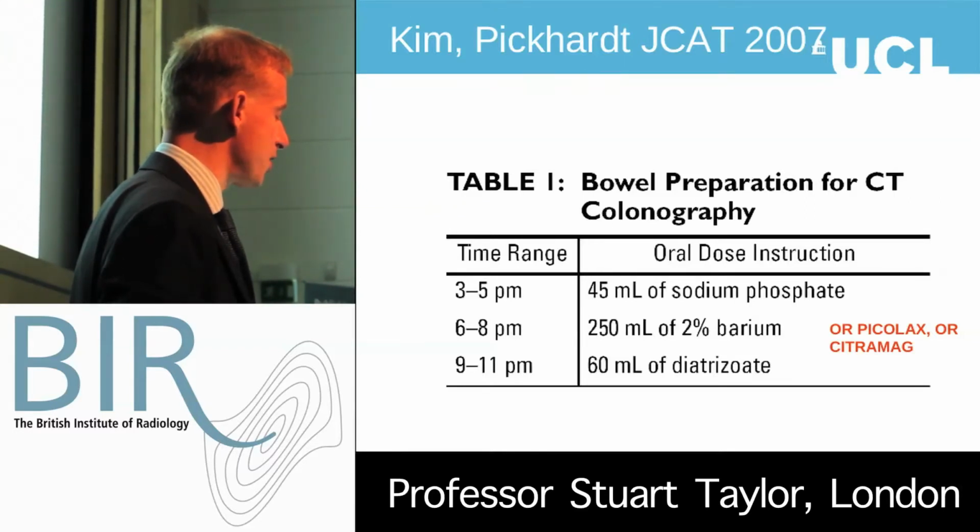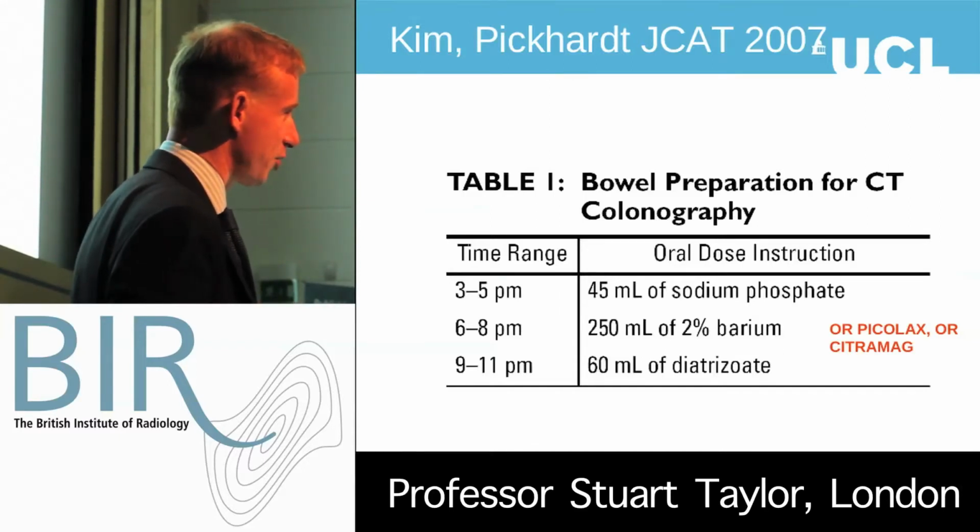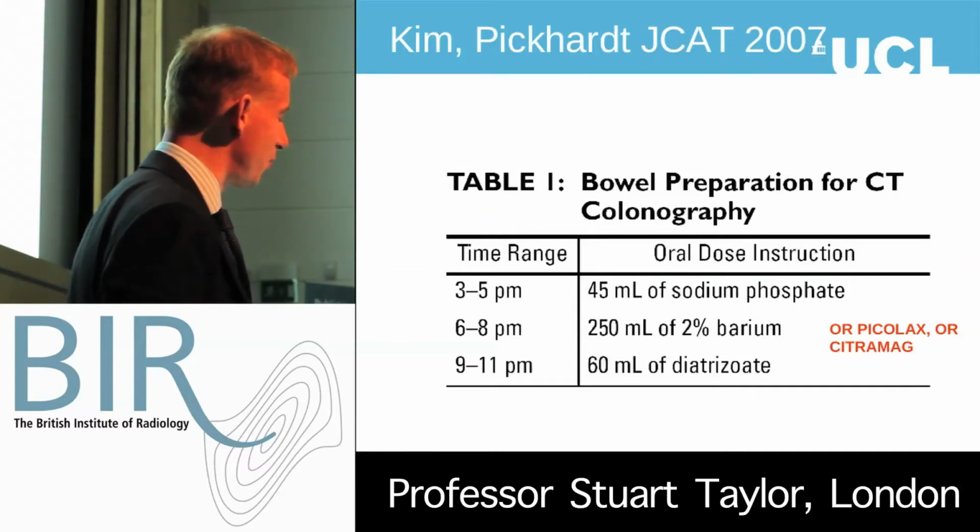We usually do that, but we find sending out the contrast in the post is very difficult. Our pharmacy is going to charge us £15 a patient to package the gastrografin and send it out to them, and our radiology manager got a bit stressed by that. So we don't do that.